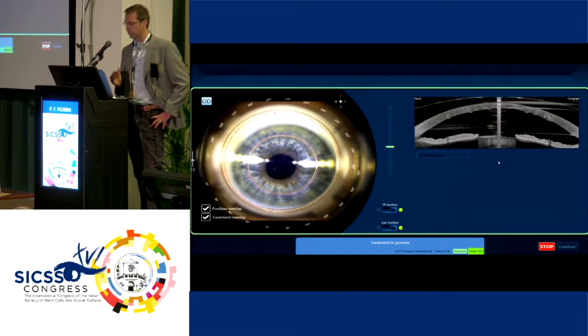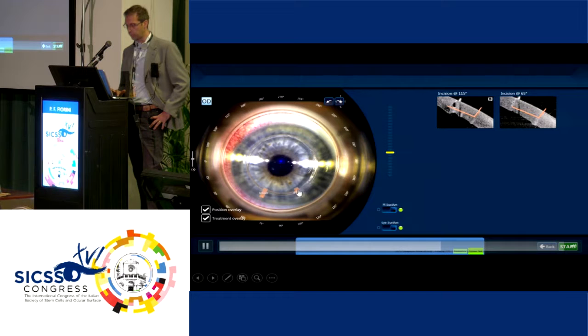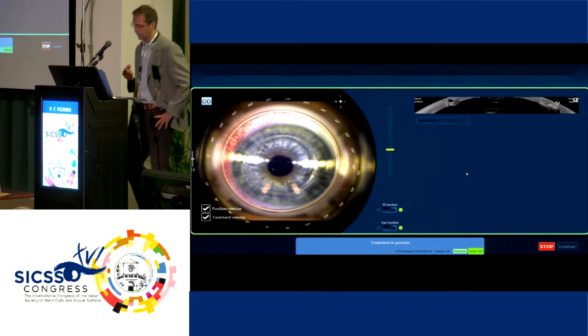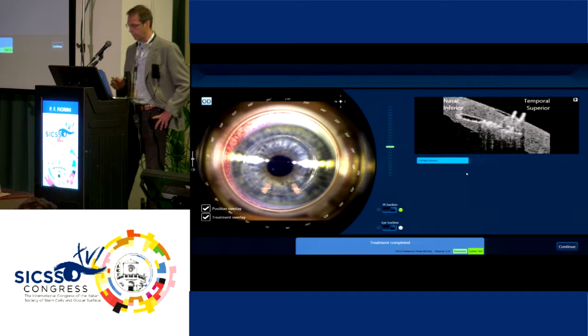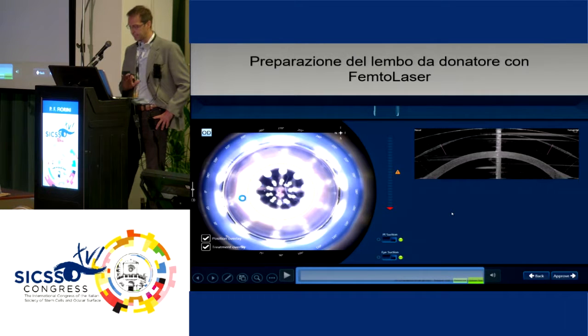Then we can get started with the cut from the deepest layer going up to the surface. In a few seconds, a perfect cut is made as deep as we like. Then with the same procedure, we make the two tunnels. Here I show you that we can move them, shift them wherever we like, back and forward, or deeper or shallower, and to one side or the other. It takes technically and literally one second. So the tunnel has just been formed. Now we will see at magnification the tunnel that has just been created.